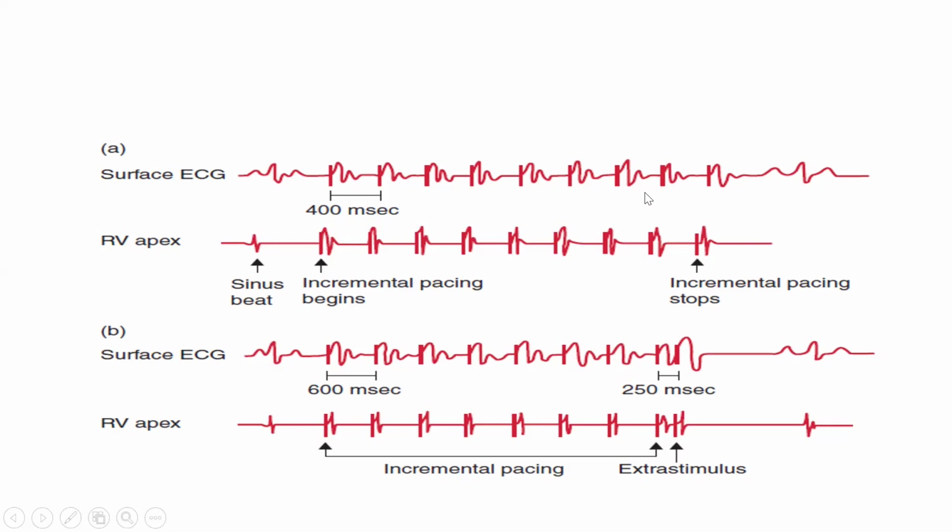They kept pacing, and at a time they stopped pacing. So they now waited for the normal SA node function of this patient to recover. The time interval between the last time they paced and the time the SA node recovered is called the sinus node recovery time. Hope that is clear.